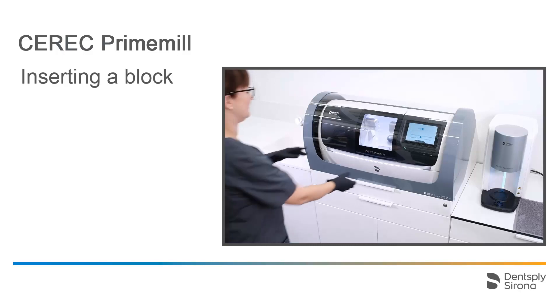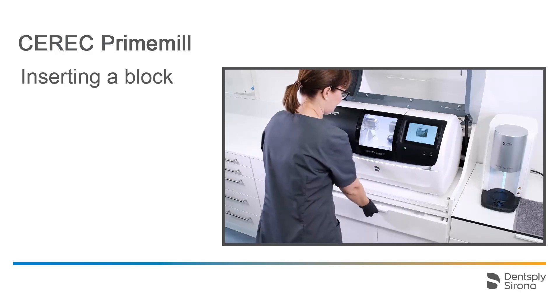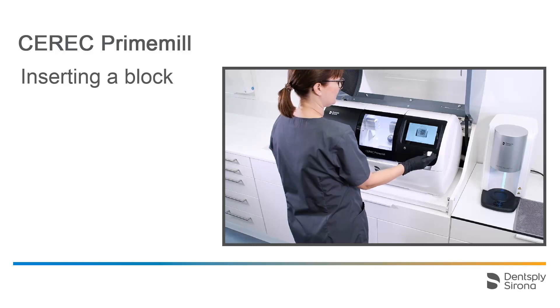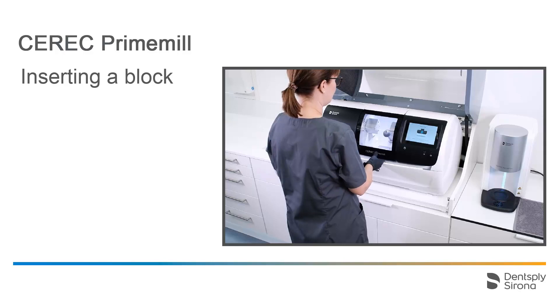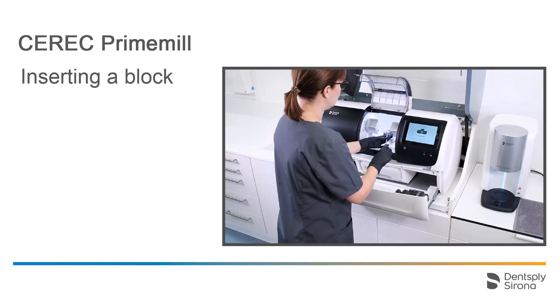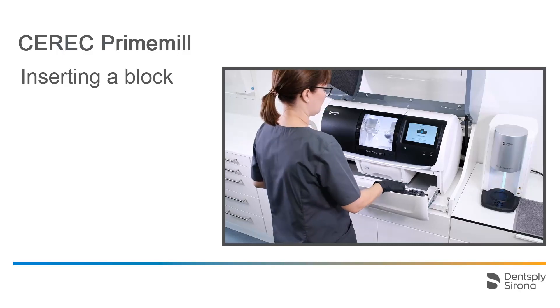To begin, tap the plus sign to select the block. The data matrix code is located on one of the block surfaces, and we guide this side toward the scanner. Next, both the motors and the block axis move to an optimal position so that the block can be positioned. Make sure that the block is mounted in its final position in the block axis. The block is fastened with the torque wrench. As soon as a click is heard and felt, the correct torque has been reached.